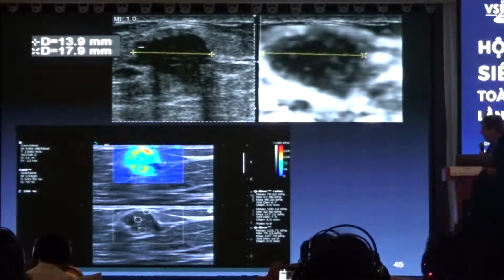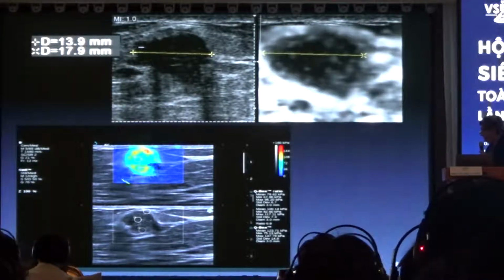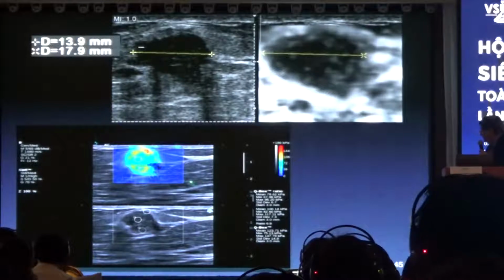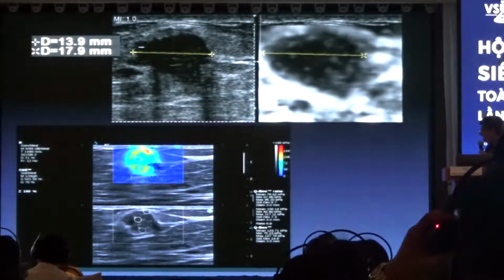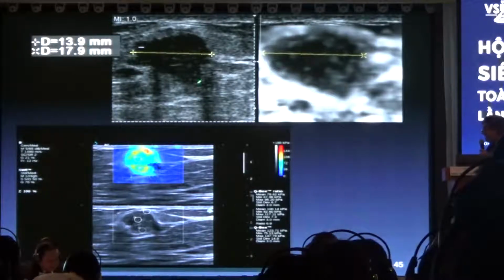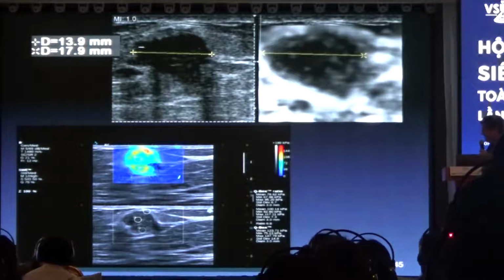Again, we talked about shear wave imaging, and I think it's the same as Dr. Dietrich said about liver. We put the big box, we get the colors. Breast cancers tend to be very heterogeneous, so we always use the stiffest value to make our diagnosis. So here, this is 123 kilopascals. And again, I use 60 as the cutoff. This was a mucinous cancer. And this is just to show you, this is the strain image, and it went from 14 to 18 millimeters. So in this case, both the strain and the shear wave imaging allowed us to make the diagnosis.